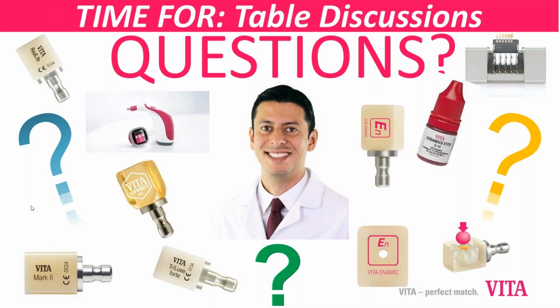But then there comes the second step, which is going with the ultra fine burr that we have in the burr block, which is this yellow diamond, and I will go around the cervical areas and the incisal or palatal edges, as you are saying, so we don't have any excess, and then we go and do the scan for the biocopy of the mock-up at that situation.